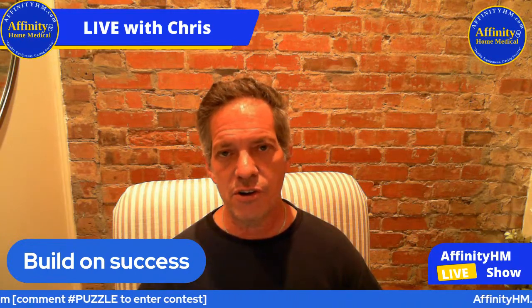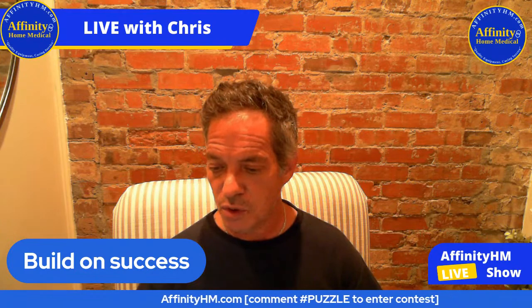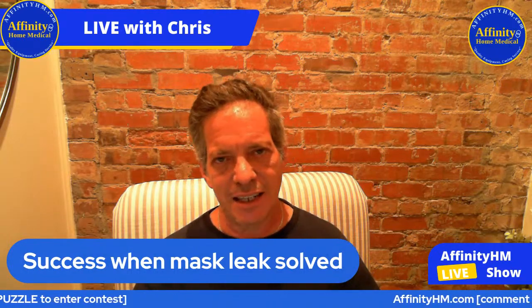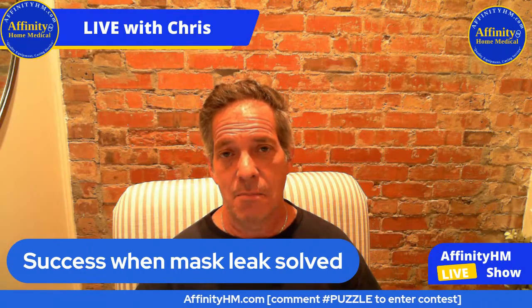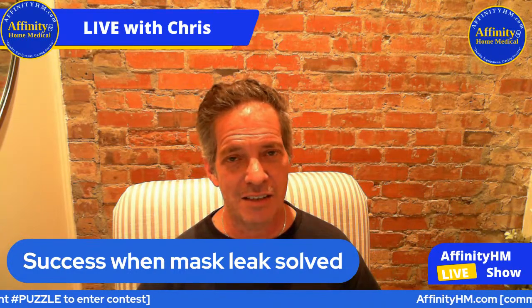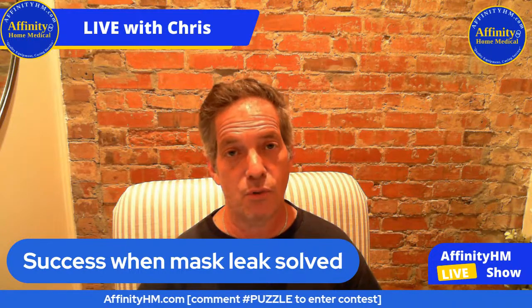So first you build your understanding, and then after you have a good understanding, build on successes. As I mentioned earlier, most people have between 1 and 3 problems or hurdles that have to be overcome in order to be successful with CPAP. So let's talk about how to have success after having a mask leak. Mask leaks are typically solved by one of two situations. One might be that you simply try a different mask or a different size, and the problem is solved. And the other, many times, is a pressure situation.